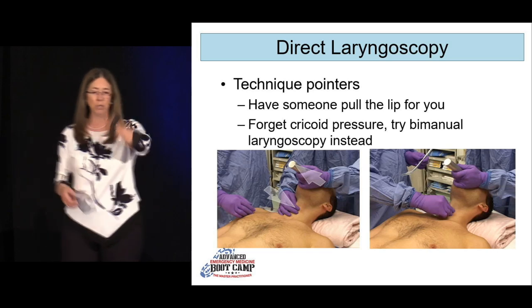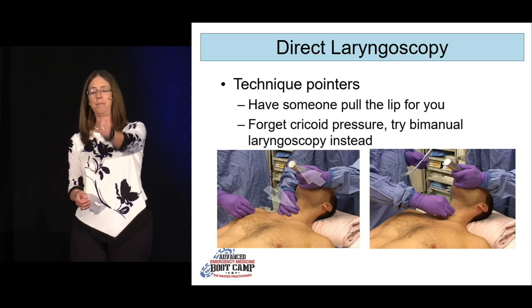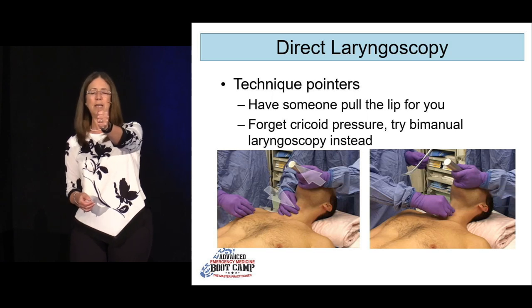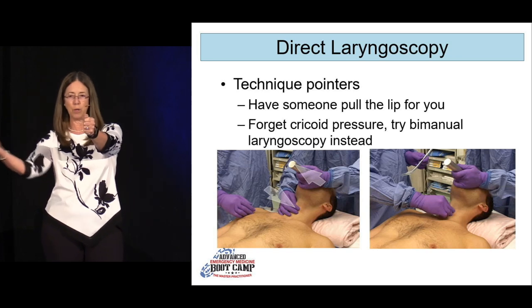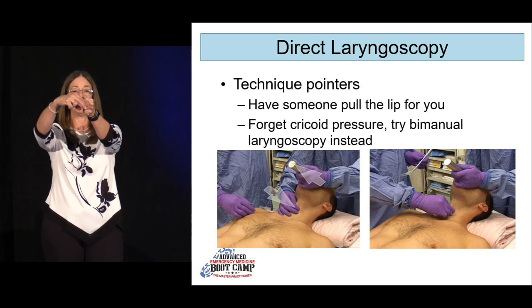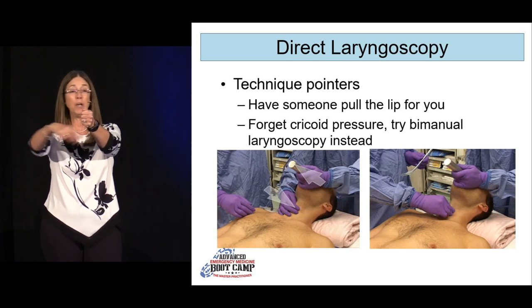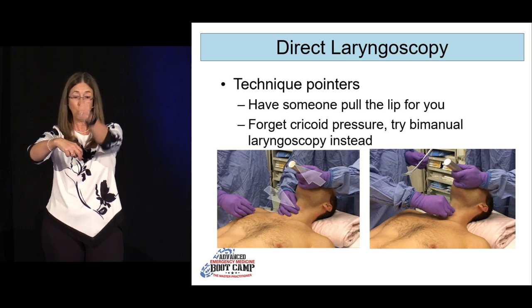What you are doing is, you're looking, okay, I did what Diane said. I came to the middle, I lifted it up, pointed a little bit to the patient's foot. Still can't quite see. I kind of see maybe epiglottis. That's all I see. You're going to reach around with your other hand. You're going to grab the thyroid cartilage, and you're going to push until you see. You're going to wiggle it around until you see. What usually happens is you're pushing down and moving it to the right, but you're watching.